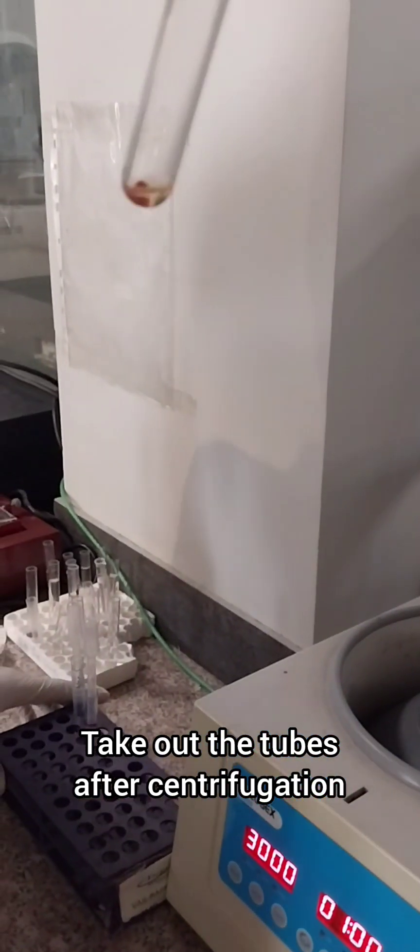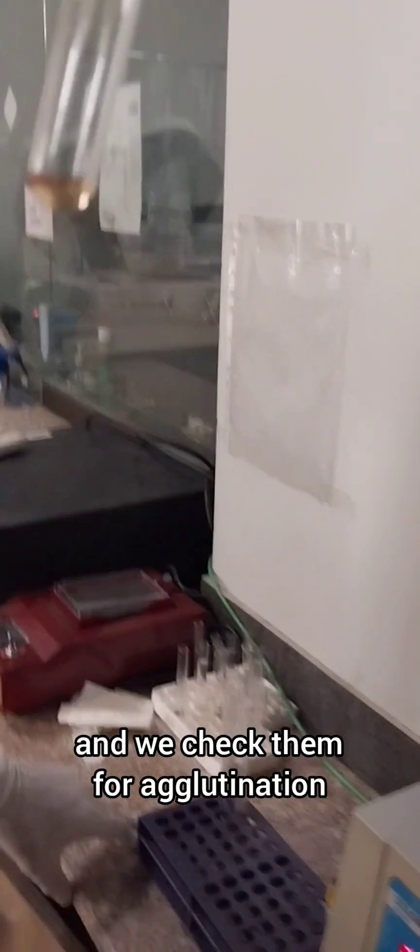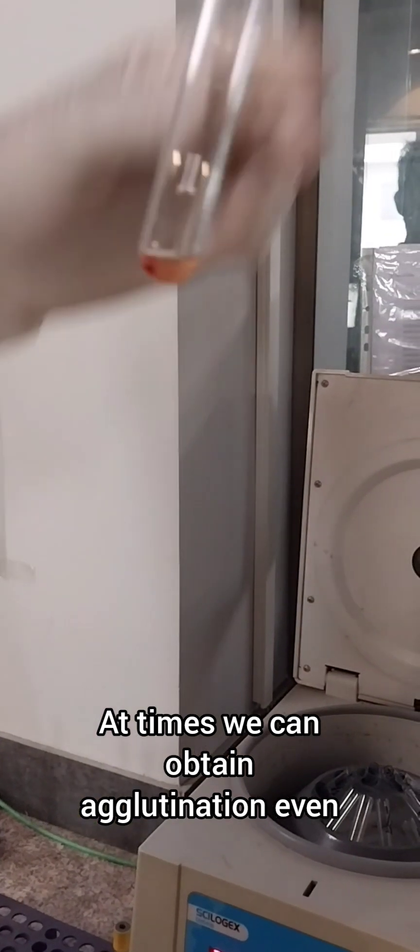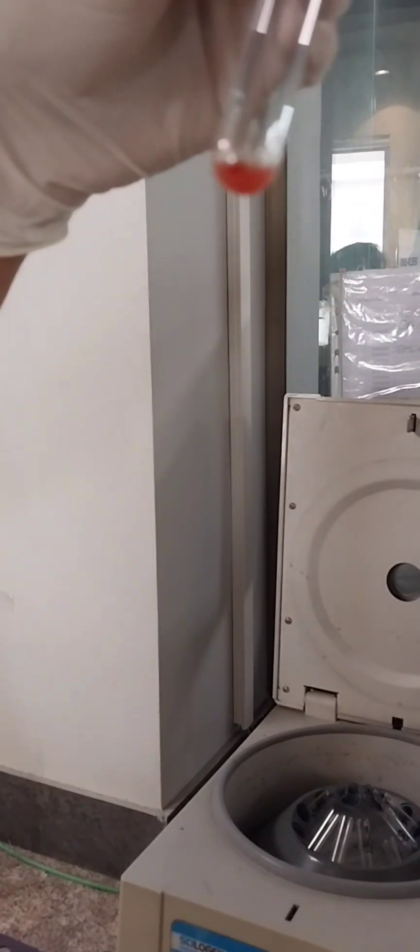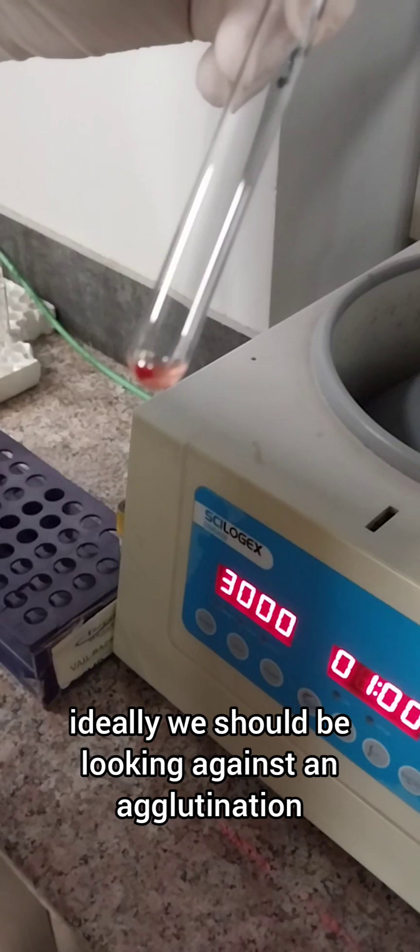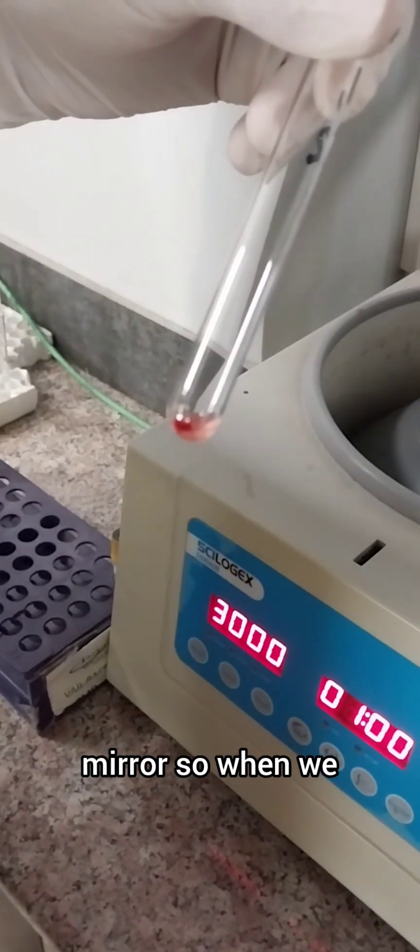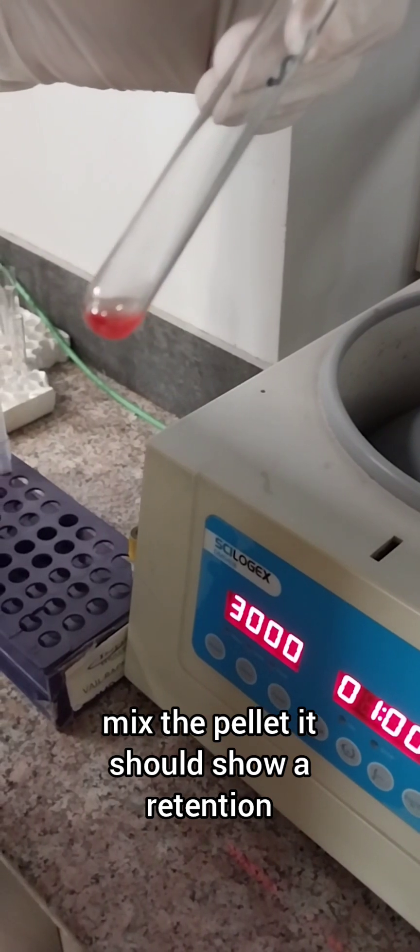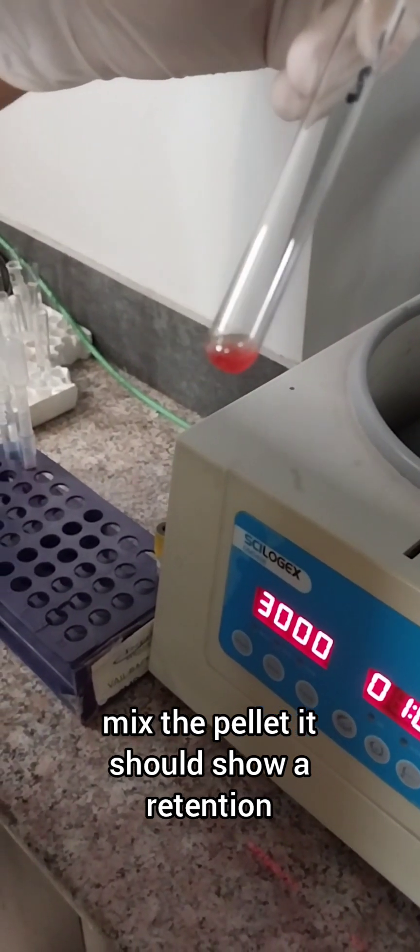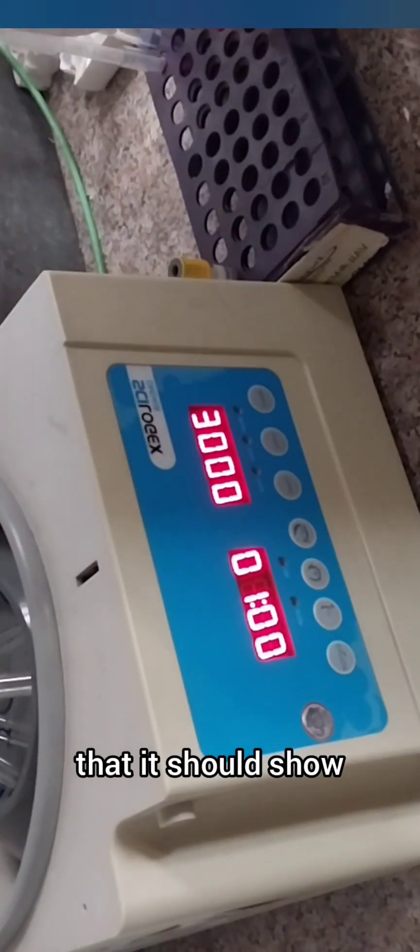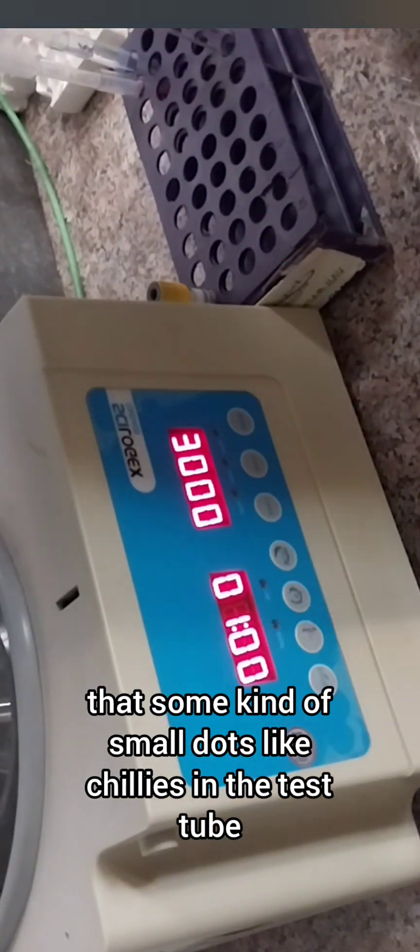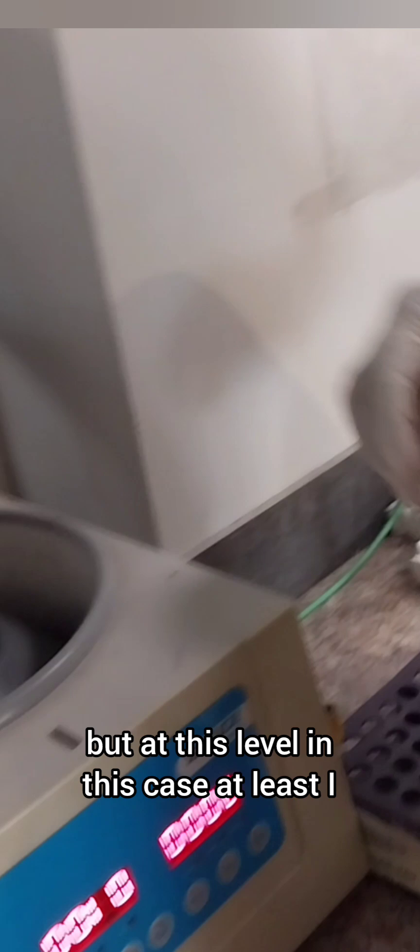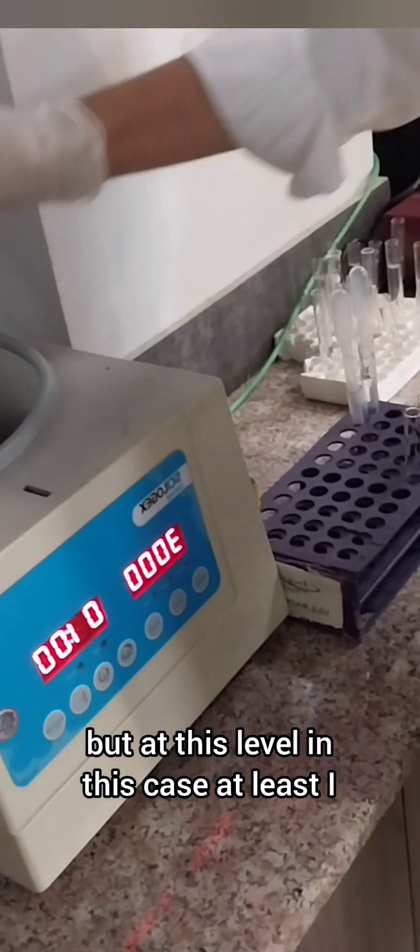Take out the tubes after centrifugation and we check them for agglutination. At times we can obtain agglutination even at this stage. Ideally we should be looking against an agglutination mirror. When we mix the pellet, it should show retention or some kind of small dots like chilies in the test tube.